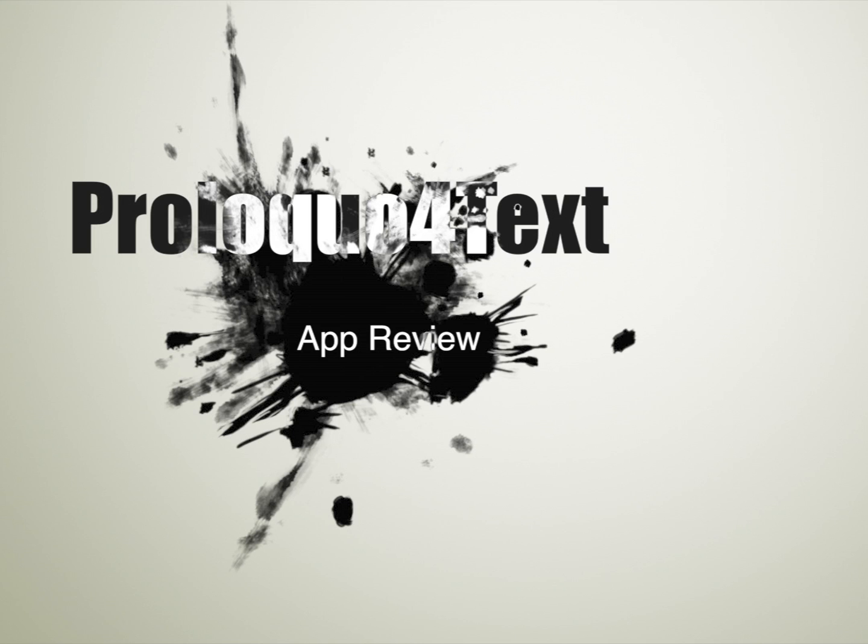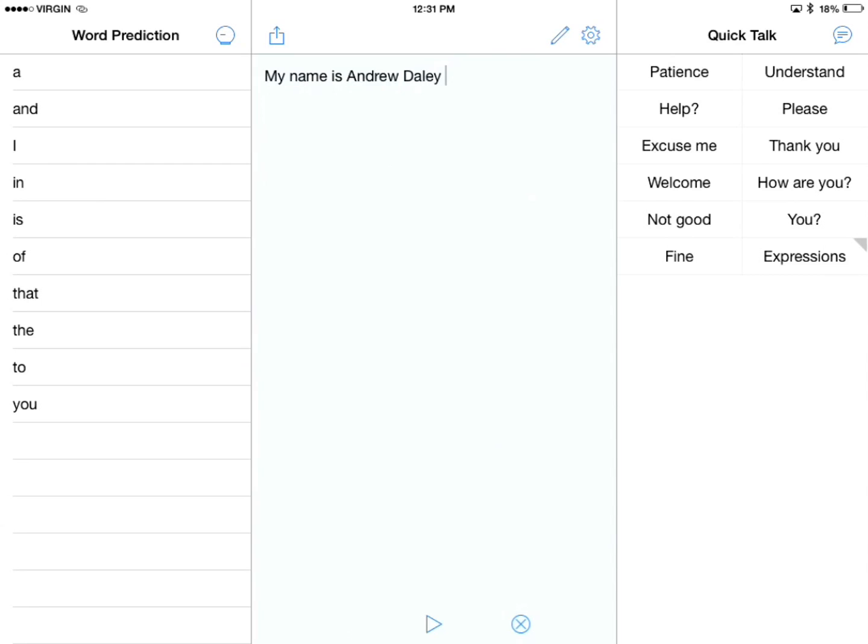The app today is called Proloquo4Text, and it's brought to us by a great company called Assistiveware. You can go visit them at assistiveware.com. The piece of software we're going to do today, of course, as I mentioned, is Proloquo4Text, and it's a piece of AAC software, which stands for Augmentative and Alternative Communication Software.